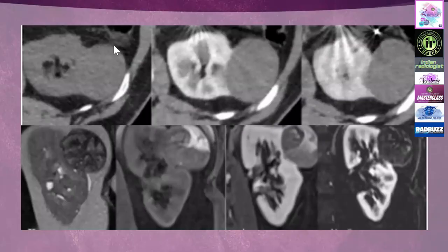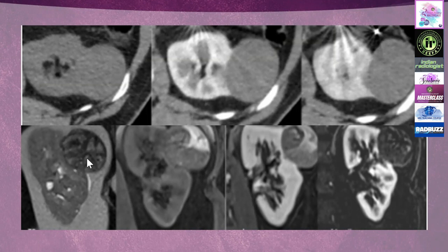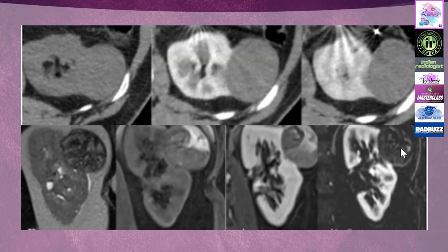Another lesion: on CT scan without contrast, arterial phase, and portal venous/nephrographic phase, we don't know whether this lesion is enhancing or not. On MRI, T2-weighted images show heterogeneity within the lesion. Pre-contrast images show an area of hemorrhage, and with IV contrast we don't know how much is enhancing. On subtraction images, you can clearly see low-level enhancement. This was another papillary renal cell carcinoma.